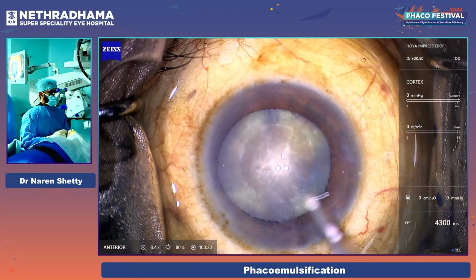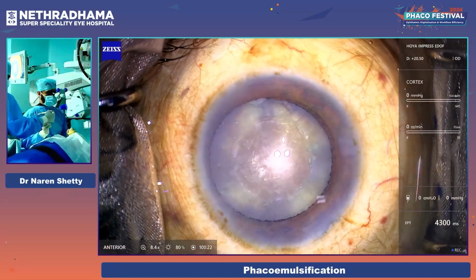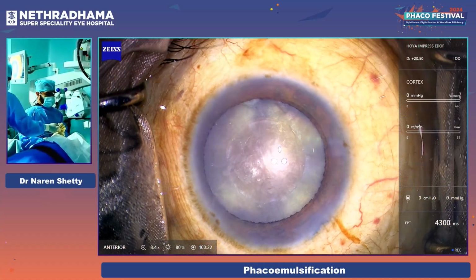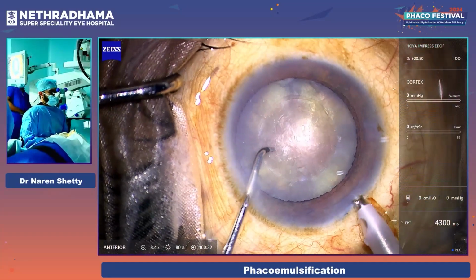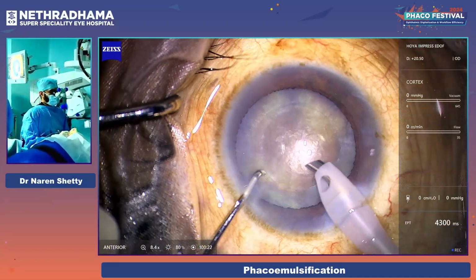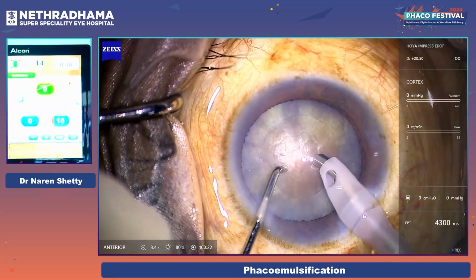Regular visco, HPMC, please. So always before you start your phaco, it's good to fill your chamber completely with viscoelastic and then start. The system which I'm using here is the Centurion system. This is not the Active Sentry handpiece. With the Active Sentry handpiece, I usually operate at 22 IOP, but with this, a little higher, maybe about 32 or so. Once you remove it, it's a little harder cataract, you can observe. That's why I didn't want to do the femto chops, just to showcase how we handle these cases with very hard nuclear grade.